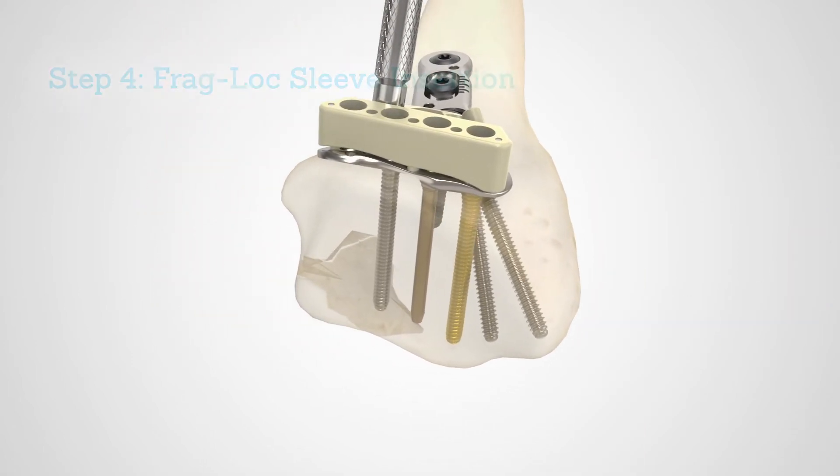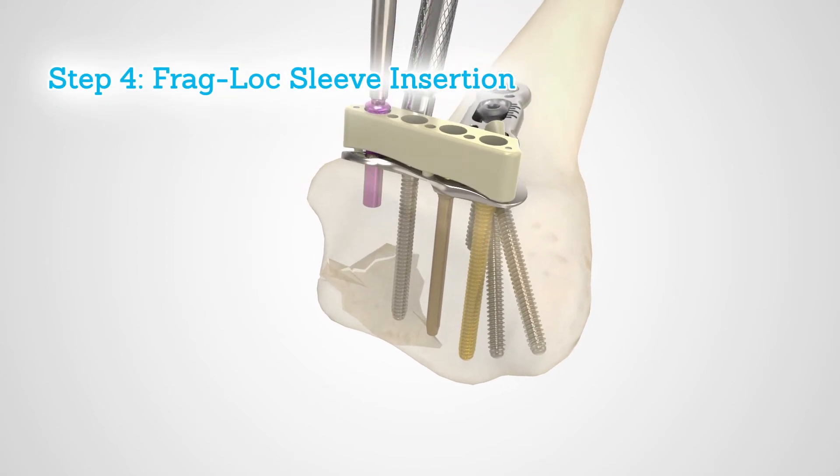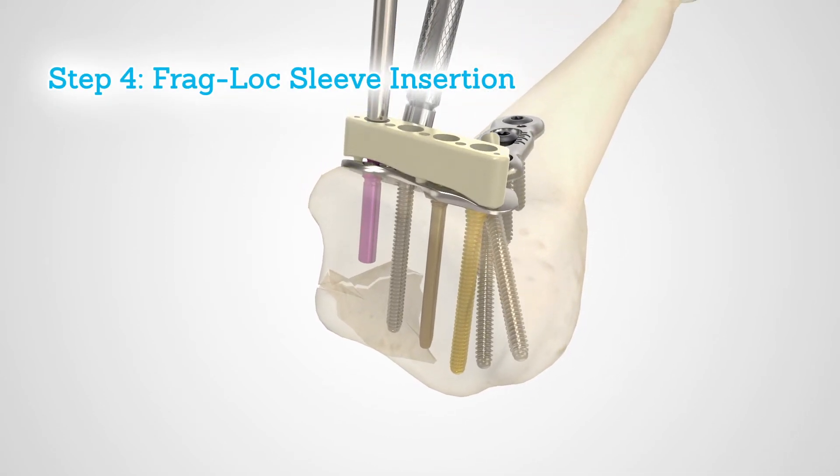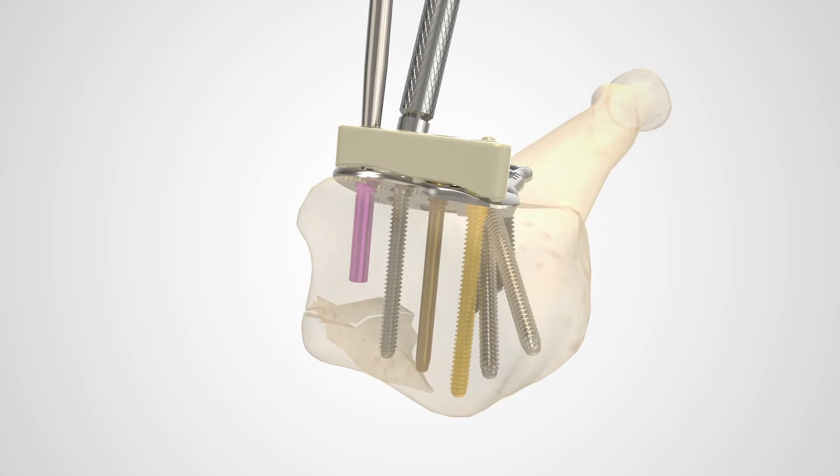Insert the FragLock compression sleeve in the plate using the cruciform driver handle and 1.5 millimeter hex driver tip.